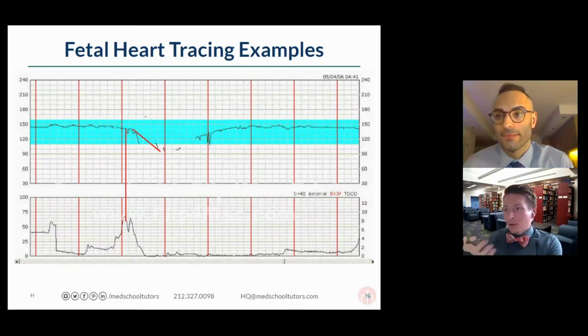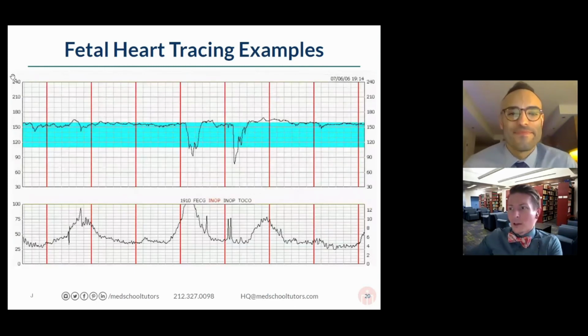So we could literally measure a late deceleration in clinic. We could assess that there is uteroplacental insufficiency. We just need a contraction to see it. That's why we're mainly looking for it during labor, because there are already contractions there. All right. Anything to add to that, Sam? No. Cool. All right. Let's go ahead and move forward.